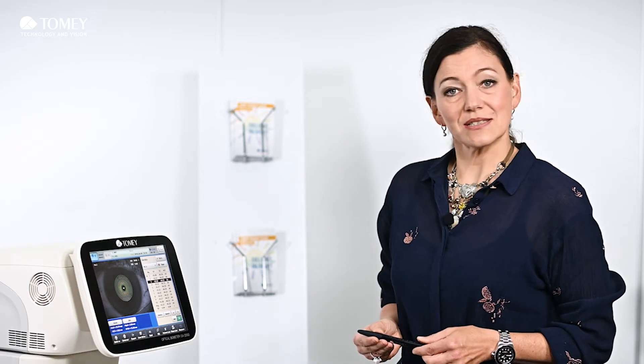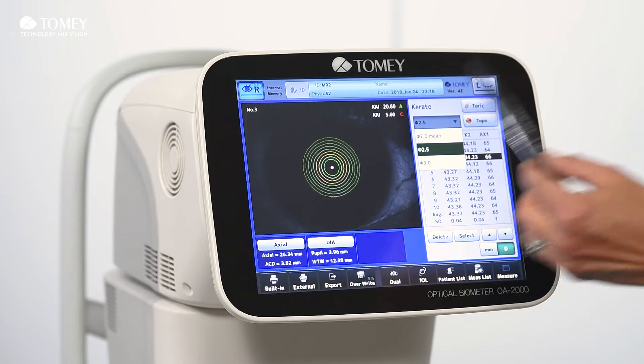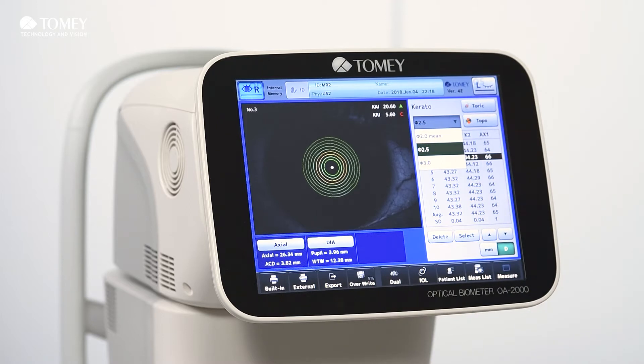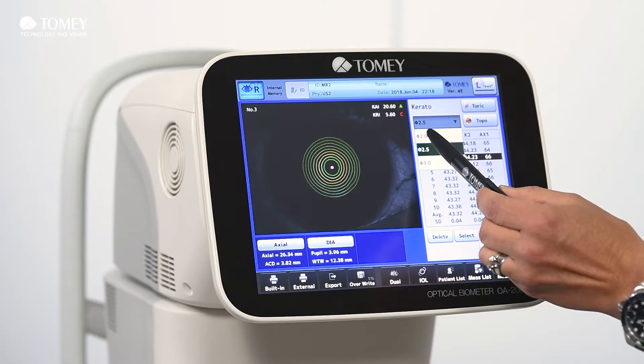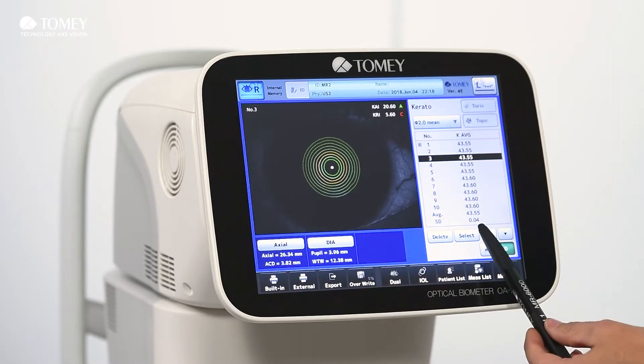Additionally, we can also display the values in different diameters. The standard is 2.5 millimeters, but some of you are using 3 millimeters, and if you have a very irregular cornea you can even use 2 millimeters. So this is a very nice additional feature.